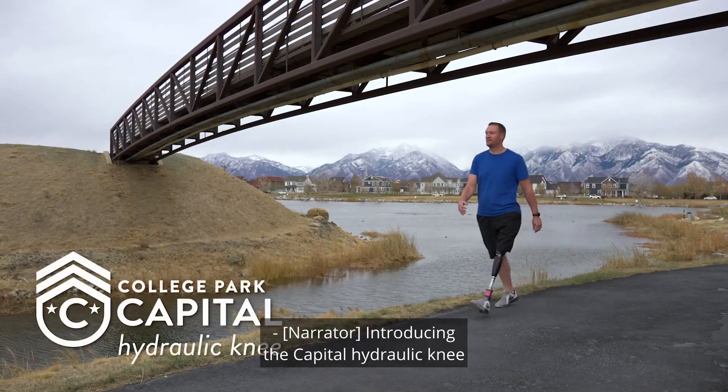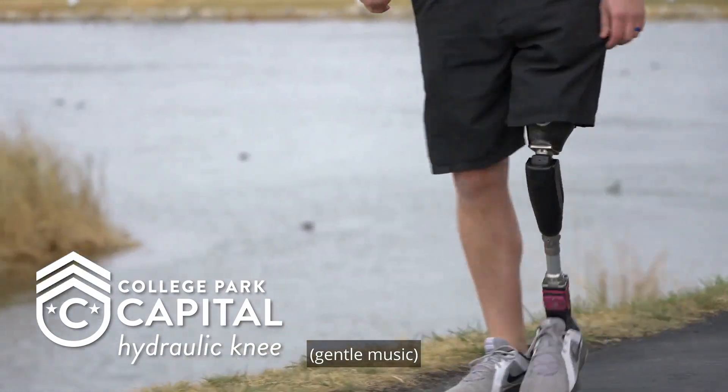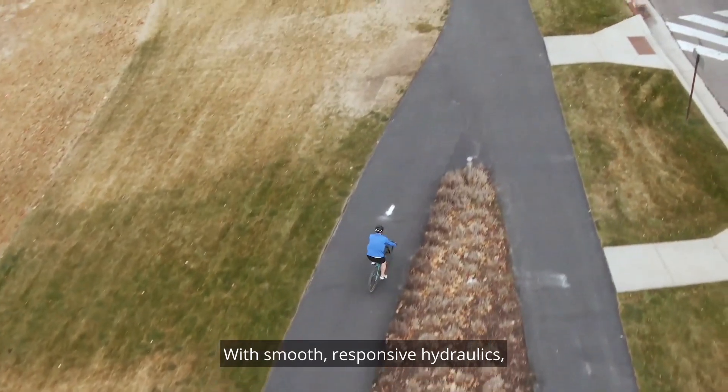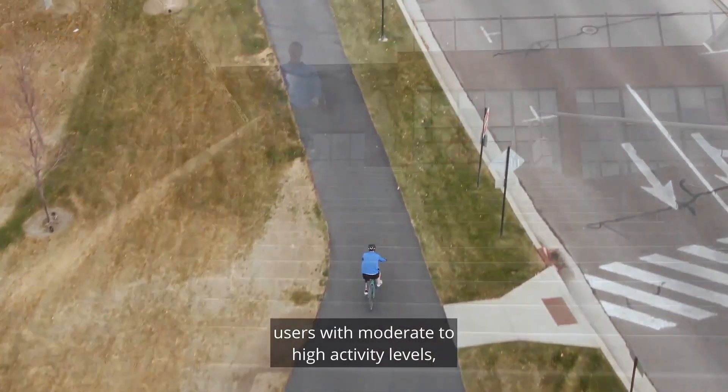Introducing the Capital Hydraulic Knee from College Park. With smooth, responsive hydraulics, users with moderate to high activity levels can enjoy more freedom.